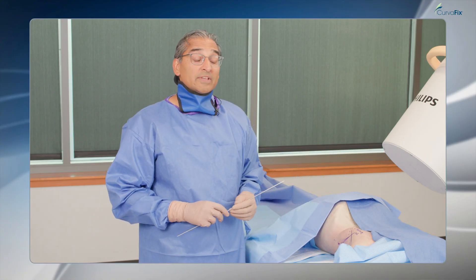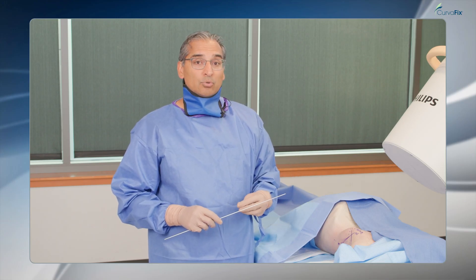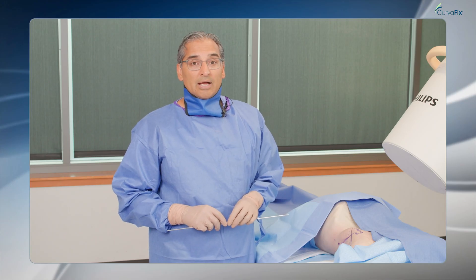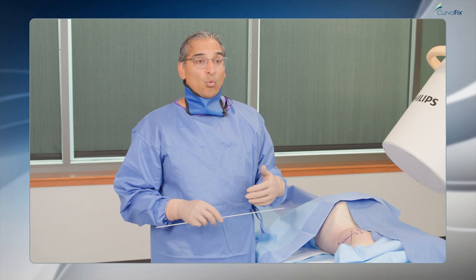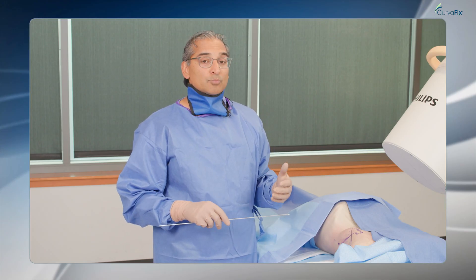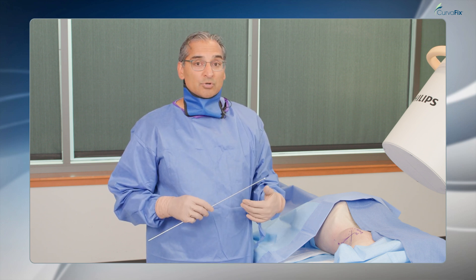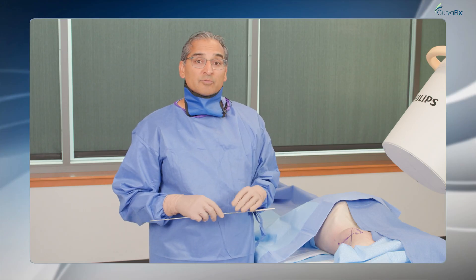One of the advantages of the CurvaFix screw is that I can place a posterior column screw in the antegrade fashion through the gluteus medius pillar. This has made placing the posterior column screw quite easy when doing it in conjunction with other fixation of the acetabulum or pelvic ring. I can do everything in the supine position, which is very advantageous from a patient positioning, imaging, and operative perspective.